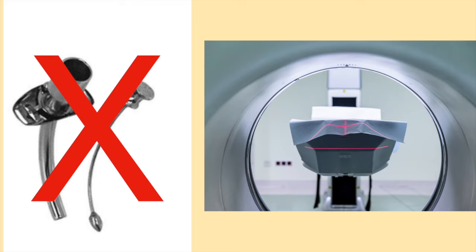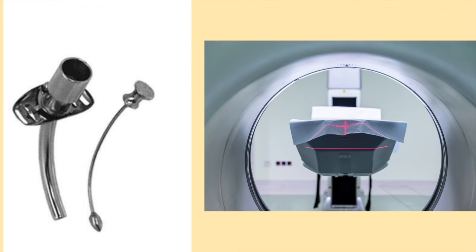Metal tracheostomy tubes are not to be used when getting an MRI. If a person needs an MRI and uses a metal tracheostomy tube, please talk to your medical provider about changing to a plastic tracheostomy tube for the MRI.